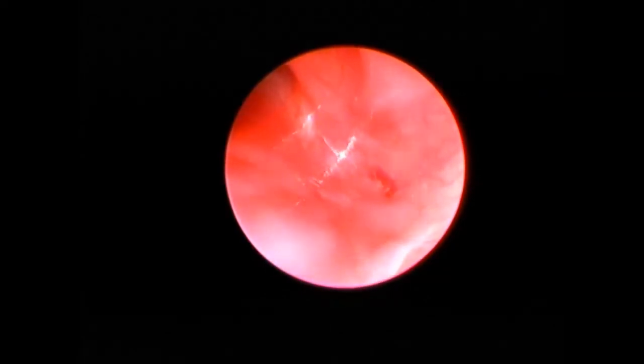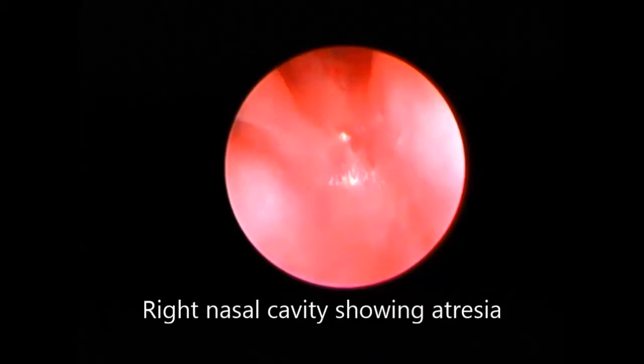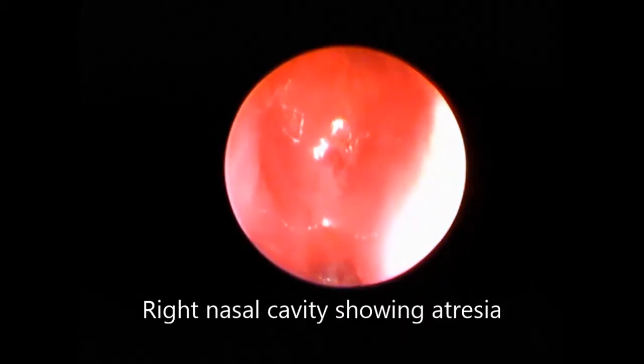Both sides are being shown. This is the left nasal cavity showing the atresia part — it was hard and bony. Then the view from the right side — again you can see you can't enter the nasopharynx; the septum and the lateral wall are showing atresia.